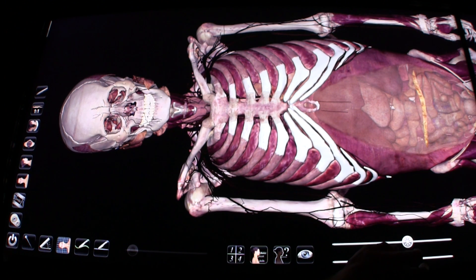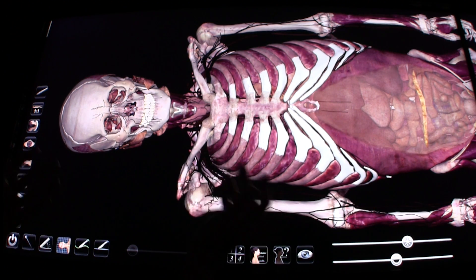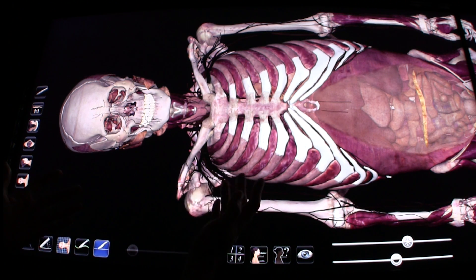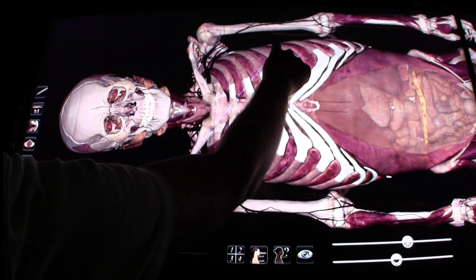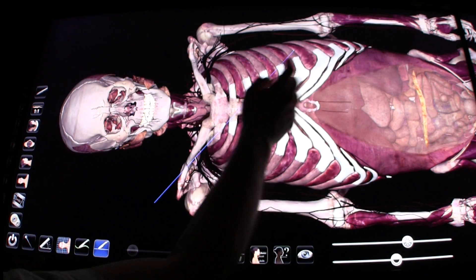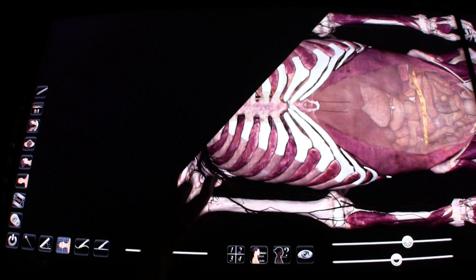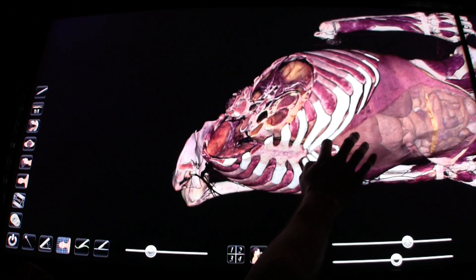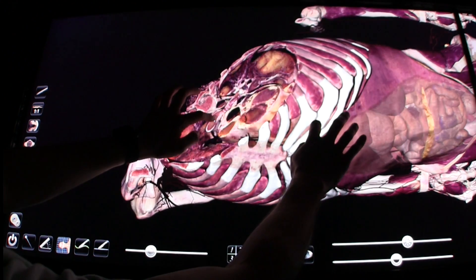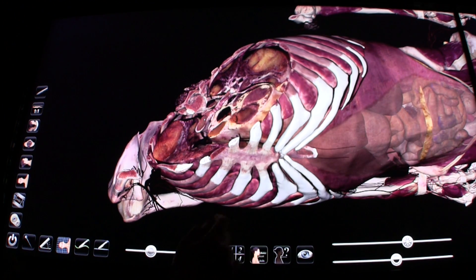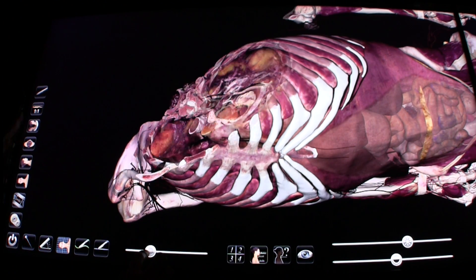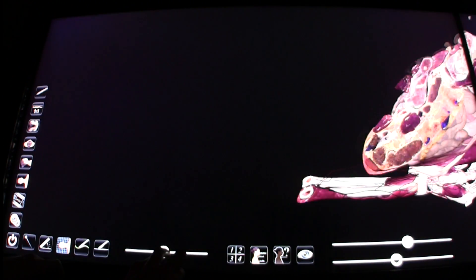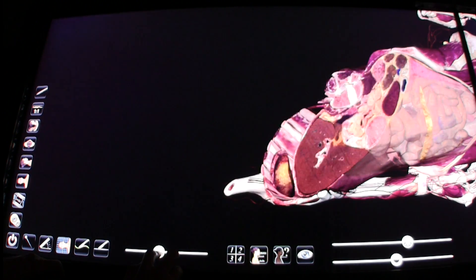Now I'm going to go over a couple of the slicing tools. The first slicing tool is right down here — it's the blue line with the scalpel. The slicing tool allows you to draw a line from any angle on the table, let go, and then tap on the side that you wish to remove and it creates a perfect cut. Because this is a three-dimensional model, you can then rotate it to look inside. The slider right beside the slicing tool moves that slice up and down through the body from the angle that you created.